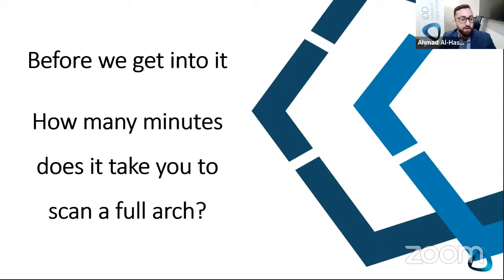I do see a comment by James, and I know we said we'll do Q&A at the end, but it's a fantastic comment. Does scanning an area over and over create inaccuracies? The long story short is yes, over scanning can create inaccuracies.